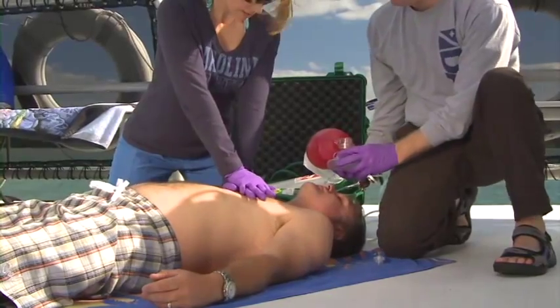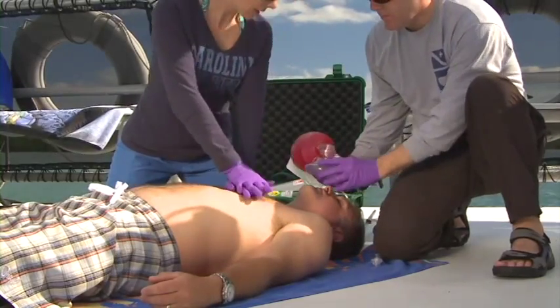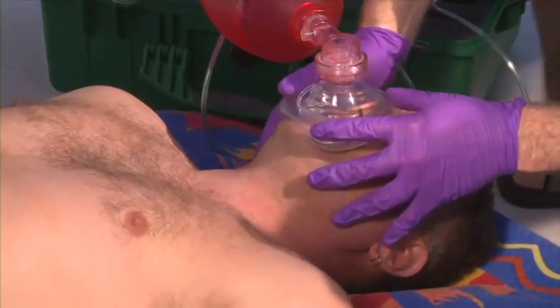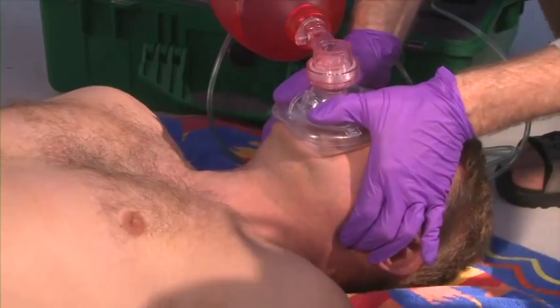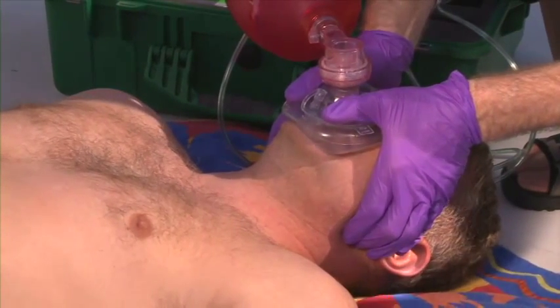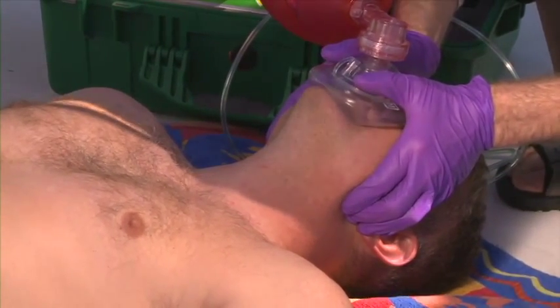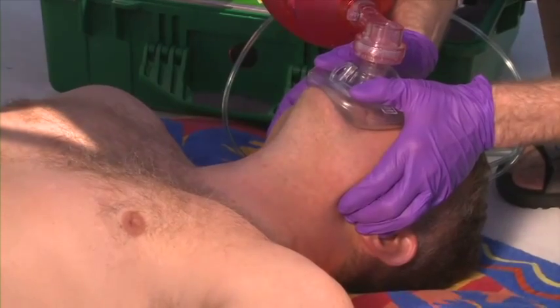When the device is ready, position yourself directly above the patient's head. Your partner should be positioned next to the patient's side. Place the mask flat on the patient's face, laying the top of the mask over the bridge of the patient's nose. Lay your thumbs along the sides of the mask, and hook your index fingers underneath the angles of the jawbone just below the patient's ears. To establish an airway, lift and tilt the patient's head, then use your fingers to lift the patient's jaw up against the mask. Use counter pressure with your thumbs to help seal the mask to the patient's face.